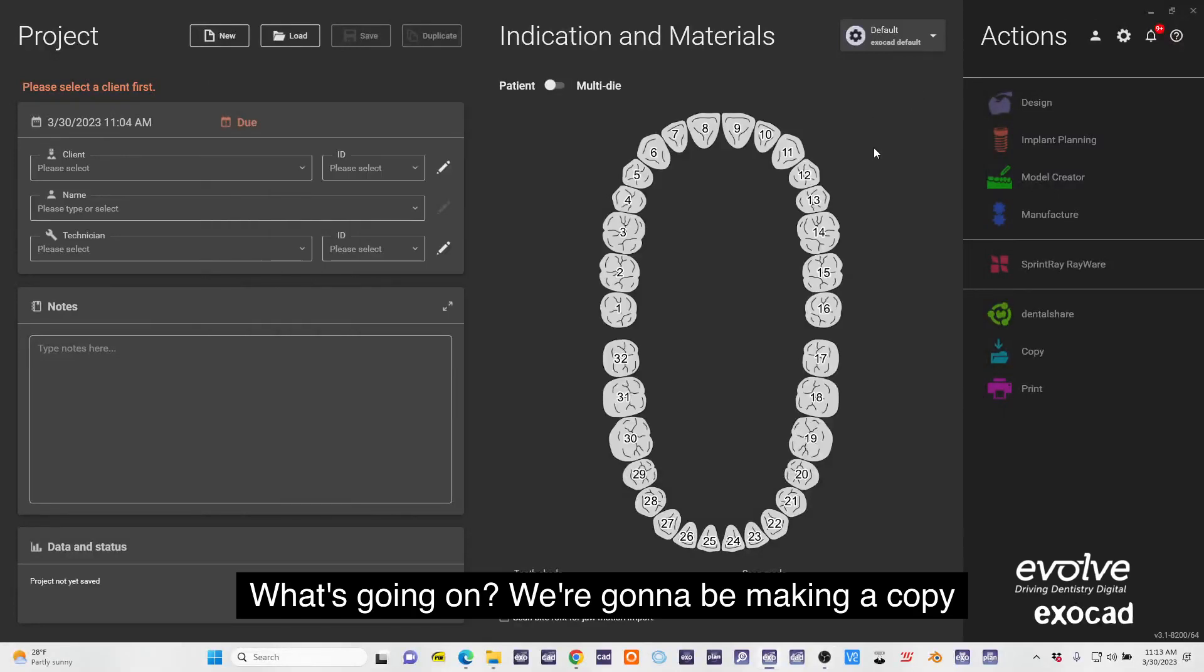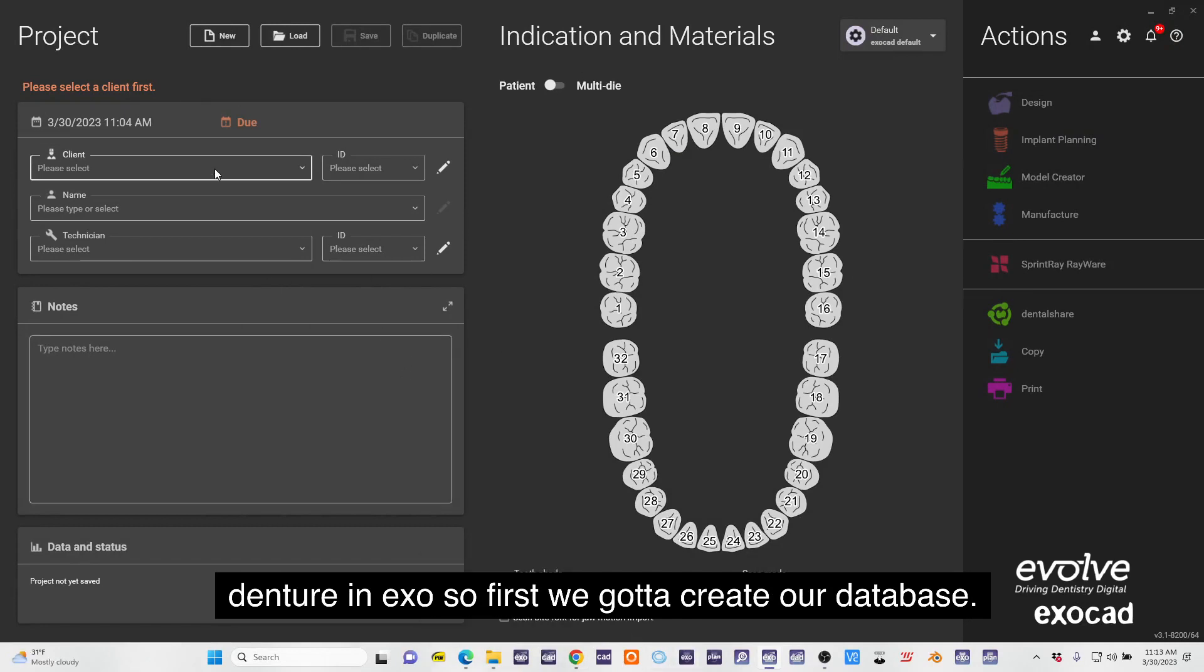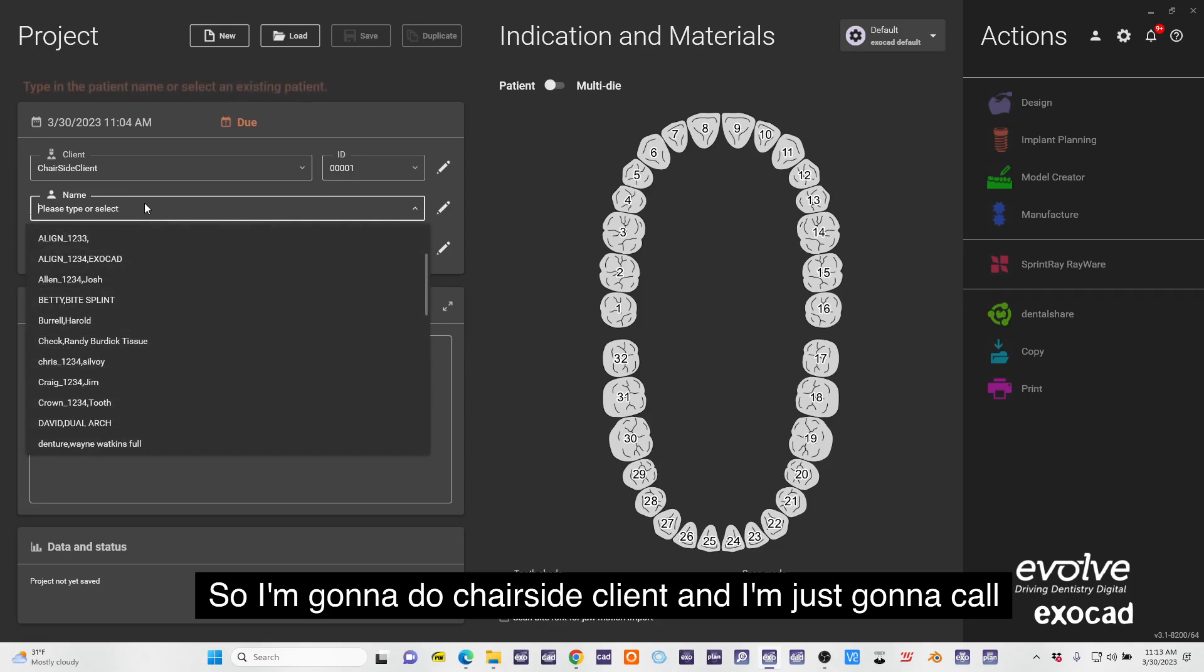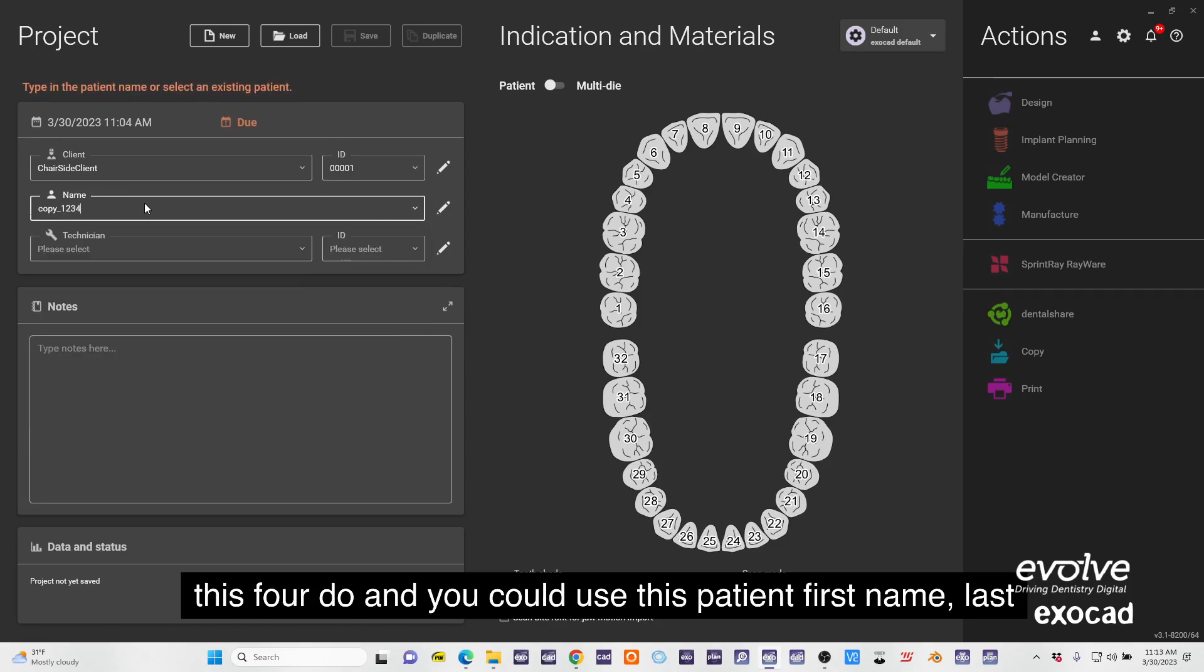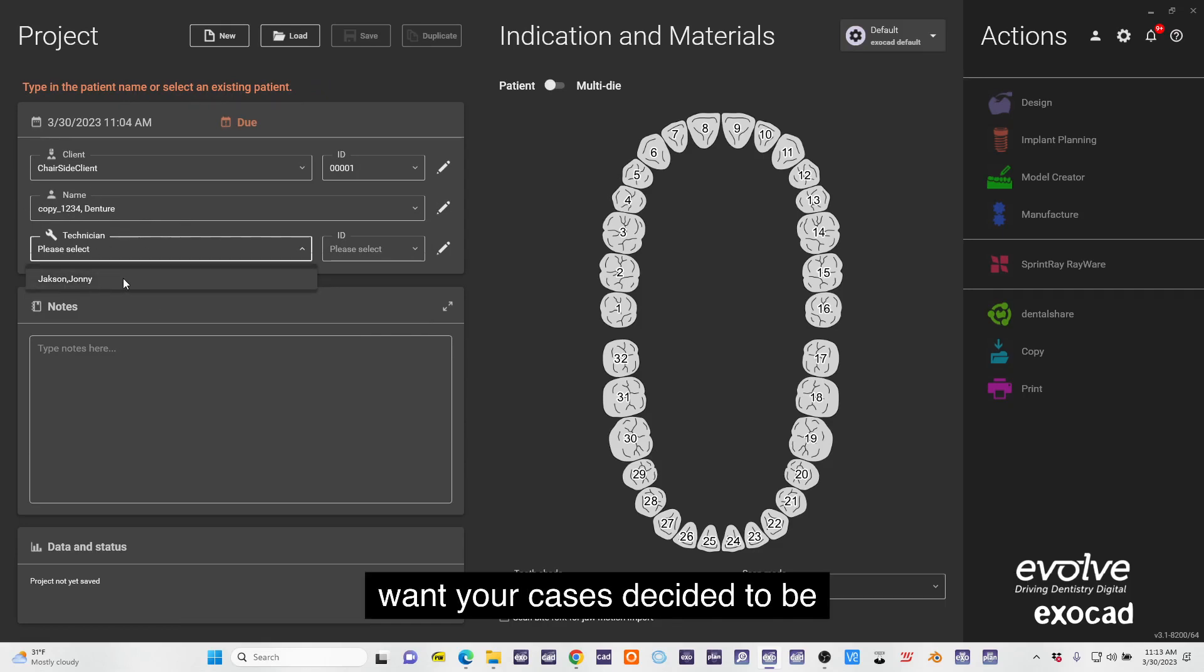What's going on, we're going to be making a copy denture in Exocad, so first we got to create our database. I'm going to do chairside client and I'm just going to call this four. You can use patient first name, last name, or however naming convention you want your cases.